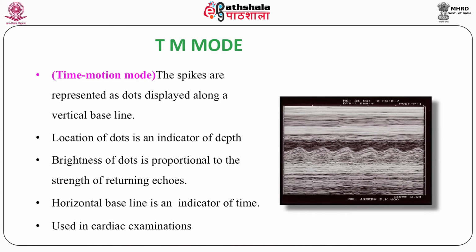The horizontal line baseline is an indicator of time. This type of TM mode is used in cardiac examination, as you can see here in the figure.